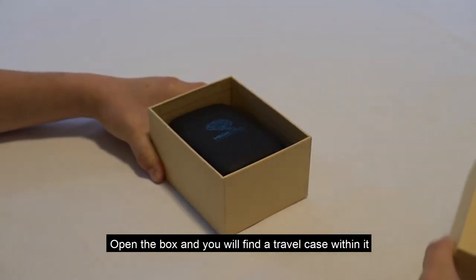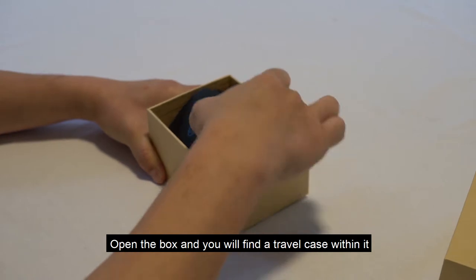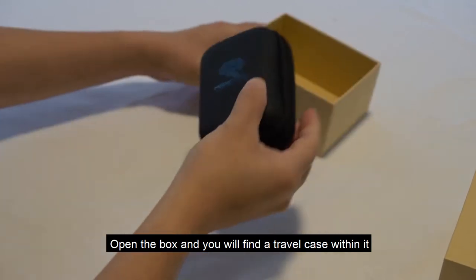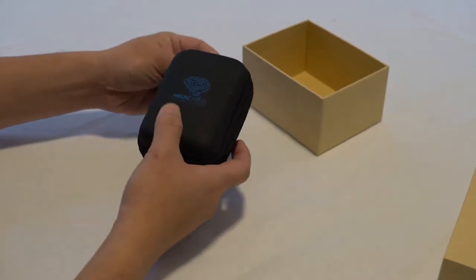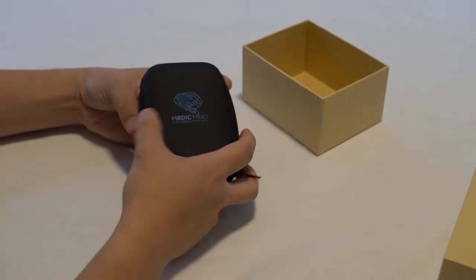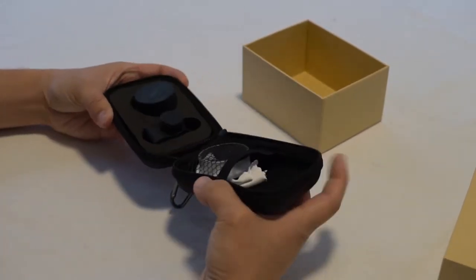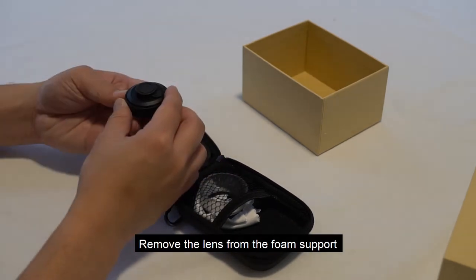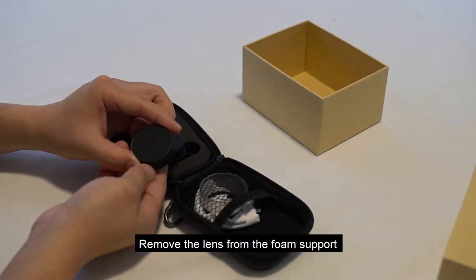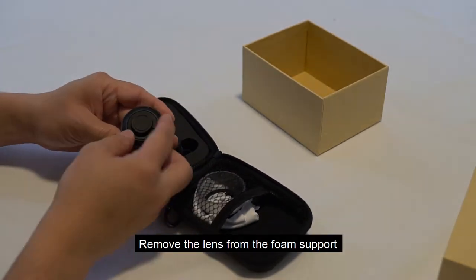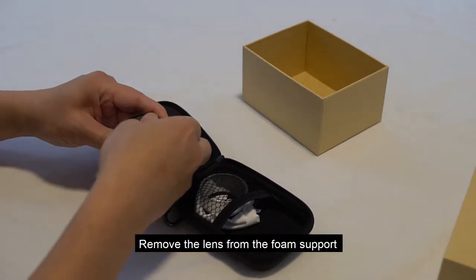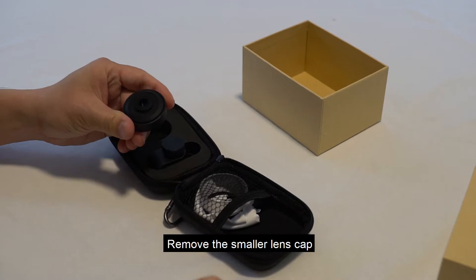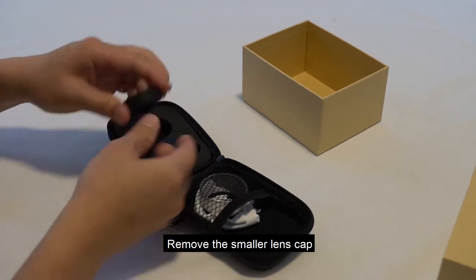Open the box and you will find a travel case within it. Remove the lens from the foam support. Remove the smaller lens cap.